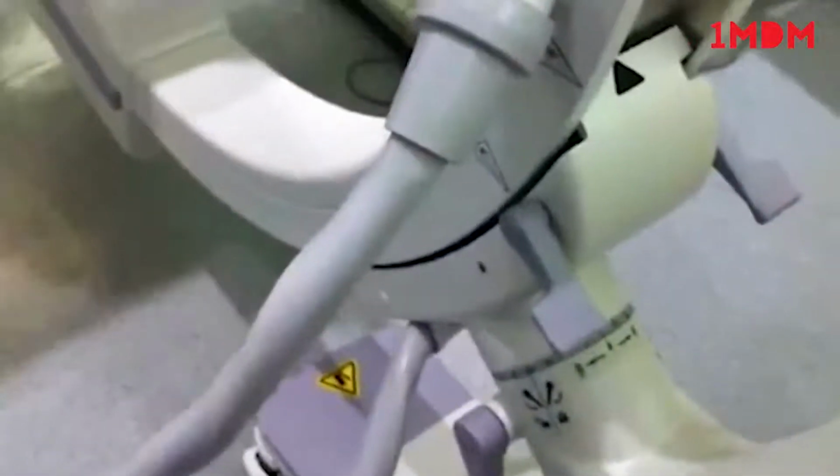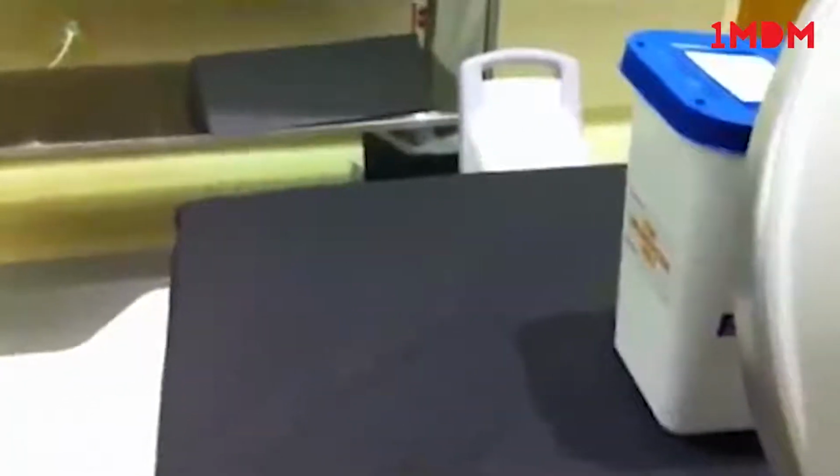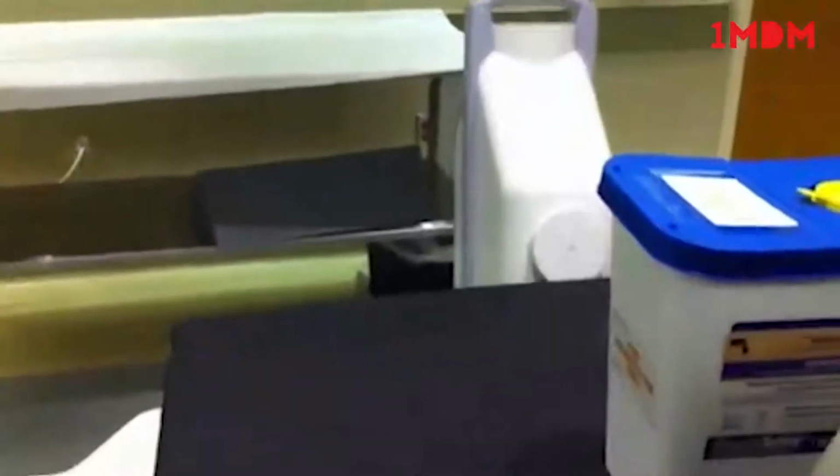With this lock unlocked, don't try to take off more than 2 locks at a time. You're just going to be struggling with the machine. Not a good idea. So as I'm swinging this with my hand, I have the ability to push it forward or backwards so that I don't strike the table. I usually tell the assistant or the surgery tech on the other side, help me watch this side come up.